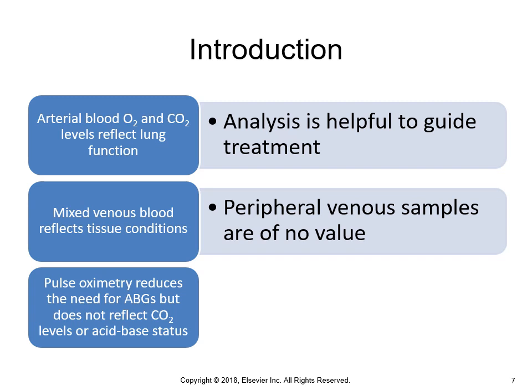Care of patients with cardiopulmonary disorders often requires special knowledge of their oxygenation, ventilation, and acid-base status. This information is obtained by blood gas and oximetry analysis. Respiratory therapists need to know when and how to obtain the measurements and how to accurately interpret them. In this lecture, we will focus on the interpretation of arterial blood gas results, as well as normal ranges for blood gas measurements.